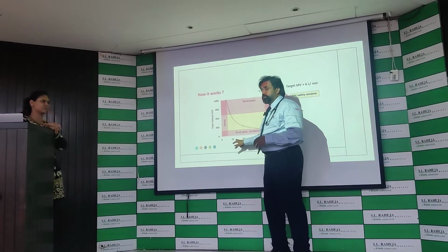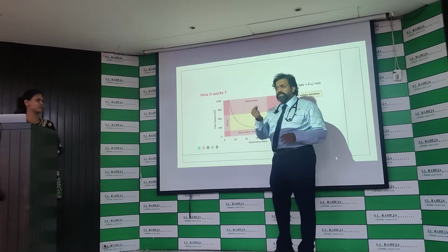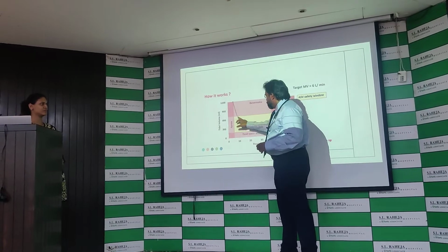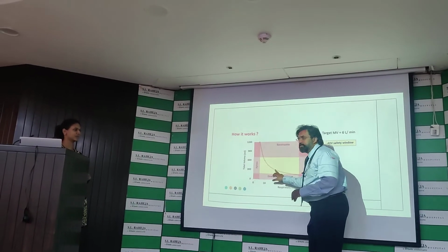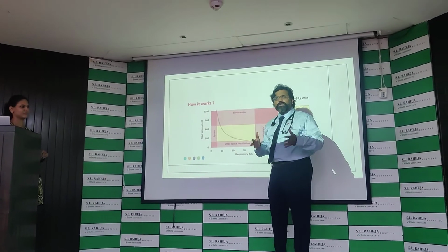If it was normal, it will ventilate this patient inside this box, and there will be a plus sign on the ventilator, which will ventilate the patient inside this box. So somehow the plus goes out here. Very soon you will see all the changes happening and the plus coming back inside this. Okay, so you don't have to do anything.